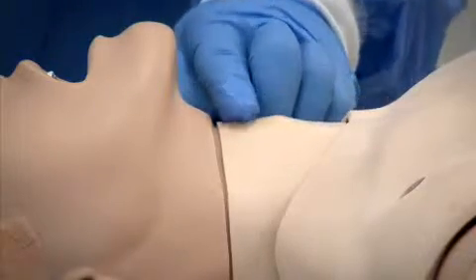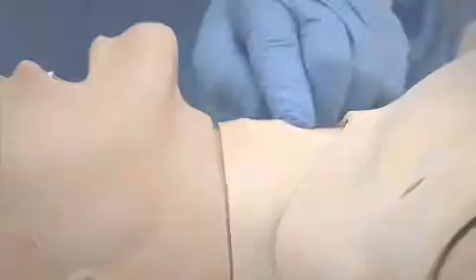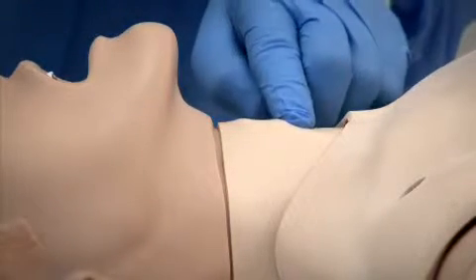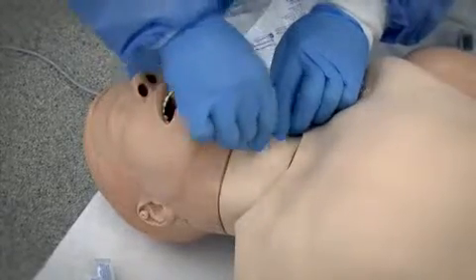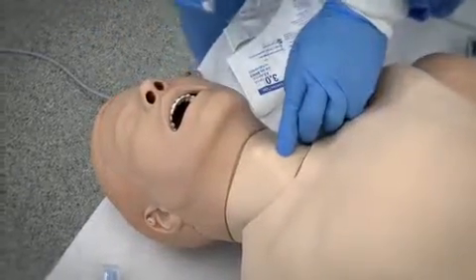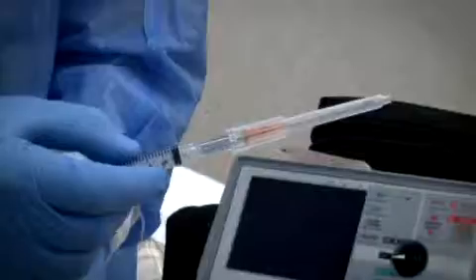Landmark for the cricothyroid membrane insertion site. This membrane is located between the inferior margin of the thyroid cartilage and the superior margin of the cricoid cartilage. Cleanse the area with an alcohol swab using an inward-outward circular motion. Maintain visual contact with the insertion site and prepare to advance with the catheter and syringe using a 45-degree caudal approach.